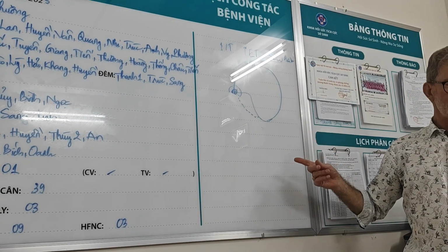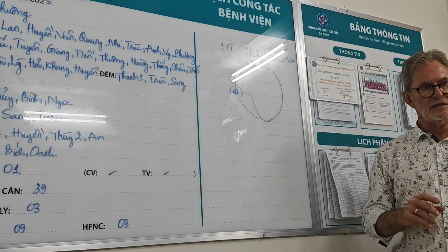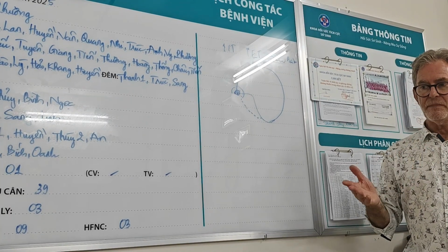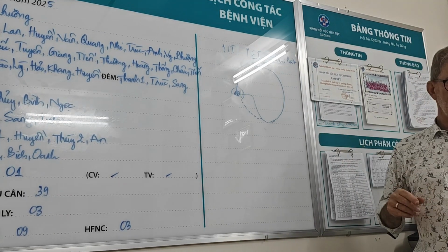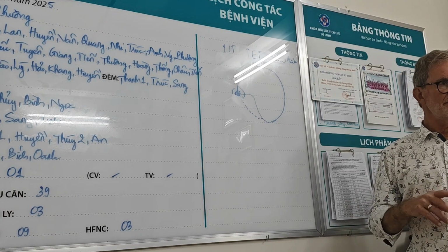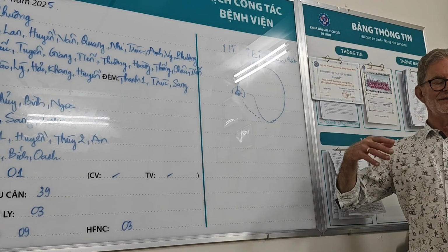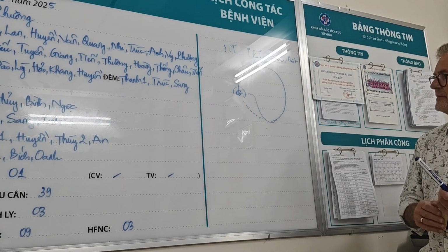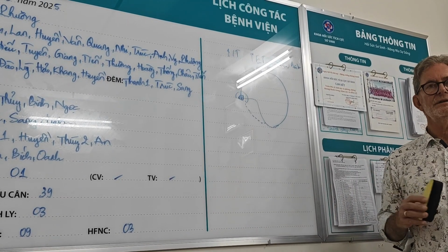So we don't generally see this in acute RDS, very unusual. Occasionally we see it in babies who've got congenital bronchomalacia, but this is certainly a recognised problem, and it's typically the very little baby who's been on and off the ventilator over a period of many weeks, and their lung disease is just getting worse, and they start to get gas trapping and auto-PEEP. So that can be an explanation for it.